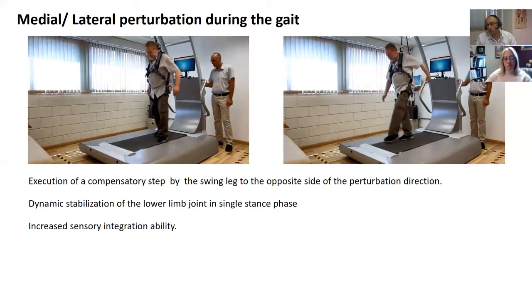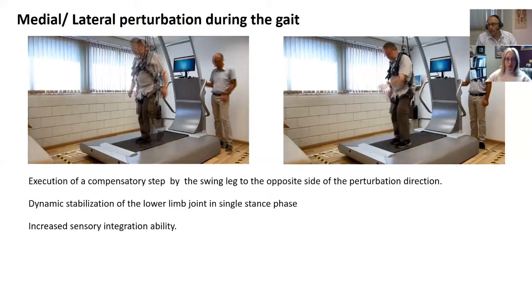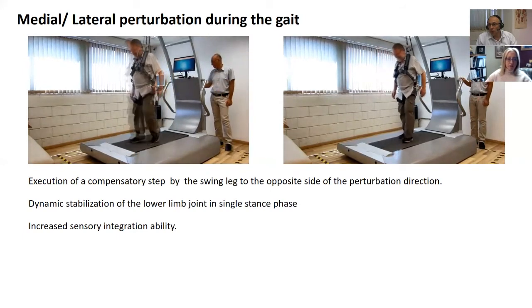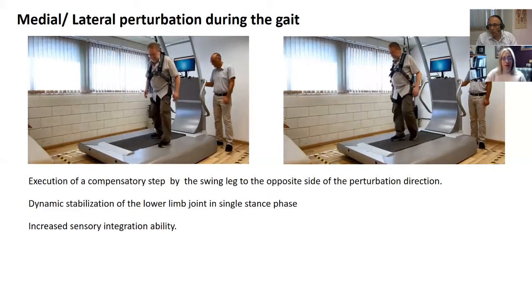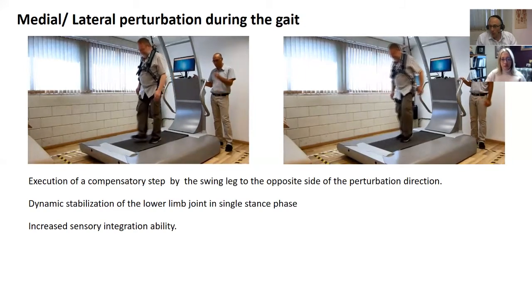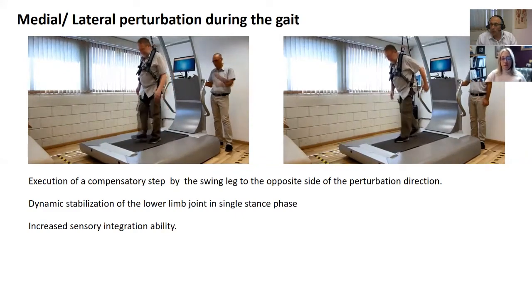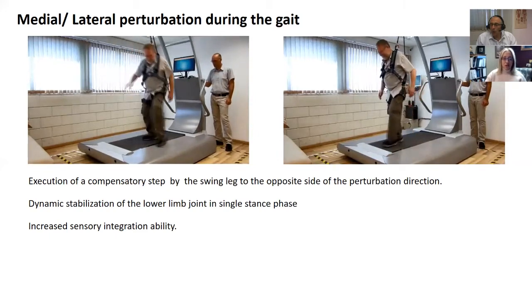No, it's very true, because not all patients will always cross over, as we see right here. And it's because of weakness. We have some, you know, as we said, he has hemiparesis to some extent. I don't know the patient well to know if he had any neglect early on or if they're still there, but he sure is working it very well, that he's still maintaining his balance and he's figuring it out in a safe environment.